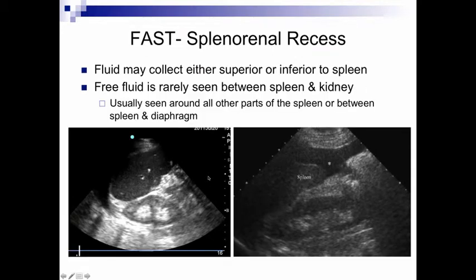So in the context of a normal study, what you'll see is a spleen with an echo texture similar to the liver. You may see a bright diaphragmatic line here. This patient has a small amount of pleural fluid, which is the anechoic material you see here, and then the kidney again with a bright fascial interface, and then renal calyces here.